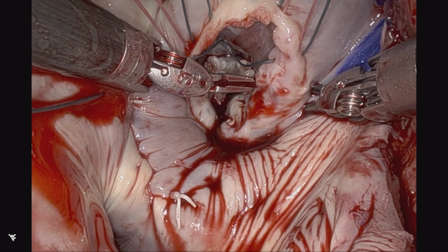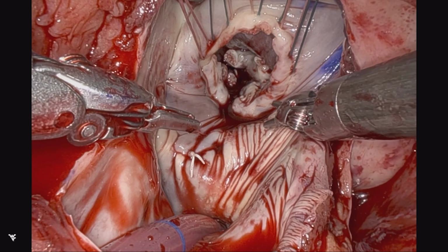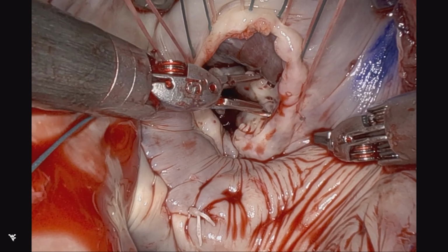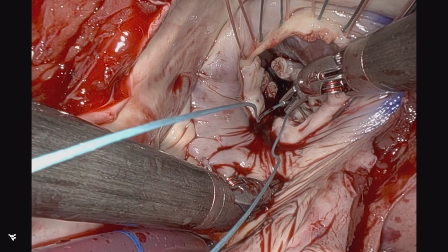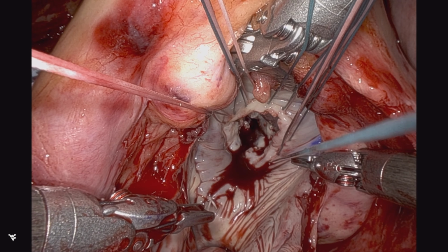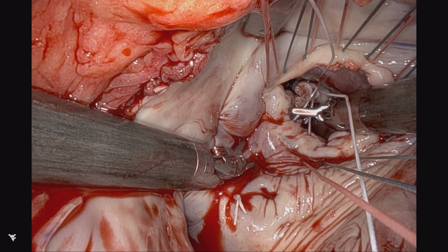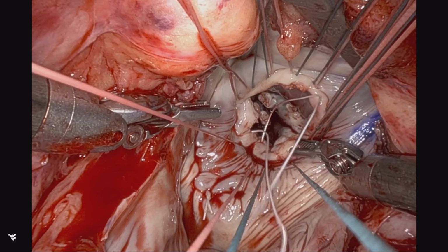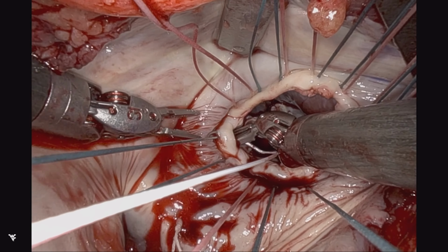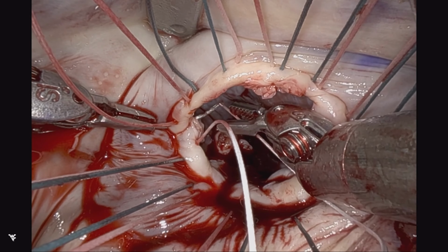Again, once I've crossed the midpoint or noon on the clock face, I'll switch to the left hand. I tend to use my DeBakey as a needle driver and a dual purpose, as I believe we've shown previously. Again, keeping the camera in its central point so that the suture management can be easily performed, and then switch back over to forehand once in the midpoint or at 6 o'clock in the clock face to complete the circumferential suture placement.